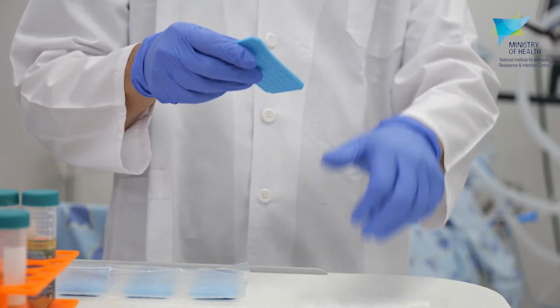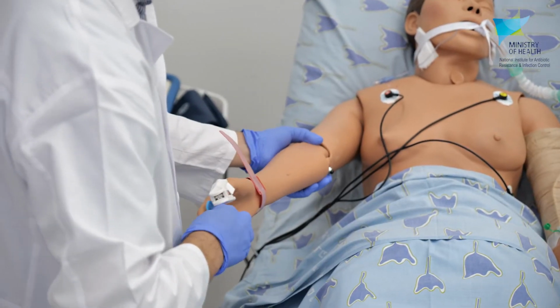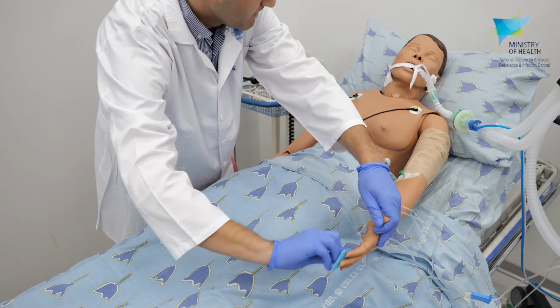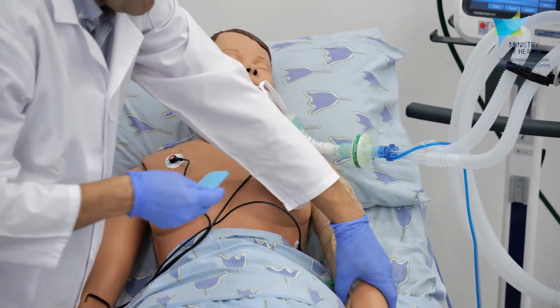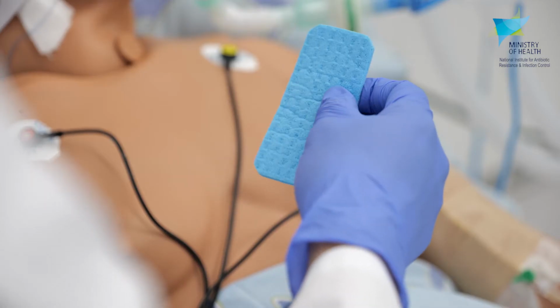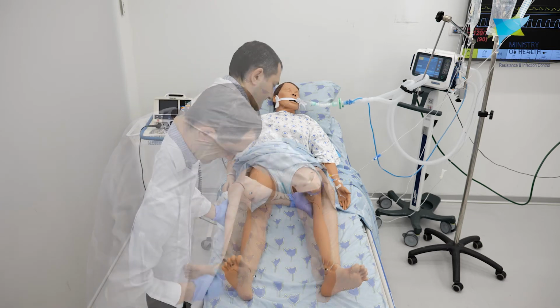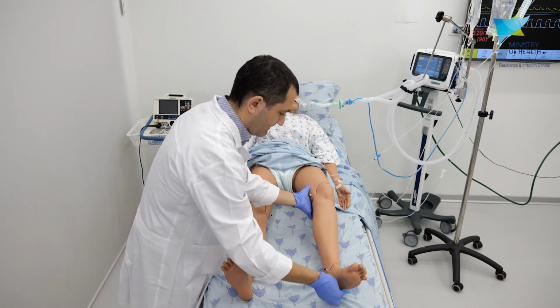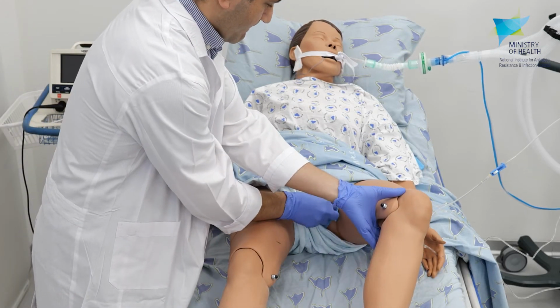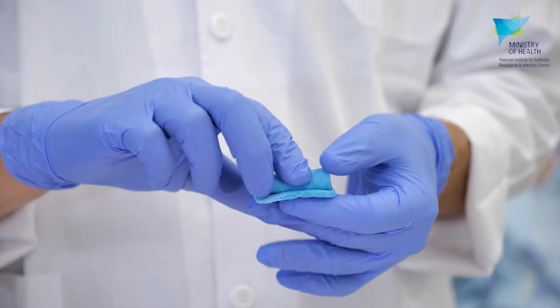Sample all 4 limbs. Start with the shoulder and continue with a sweeping motion down to the palm. Repeat on the other side, then sample the armpits. Now move on to the legs. Use the other side of the sponge swab and the same technique. Start at the thigh and continue down to the foot and finish by sampling the inside thigh. Then repeat on the other side. Sampling more body sites and a larger skin surface area improves the detection of CRAB.